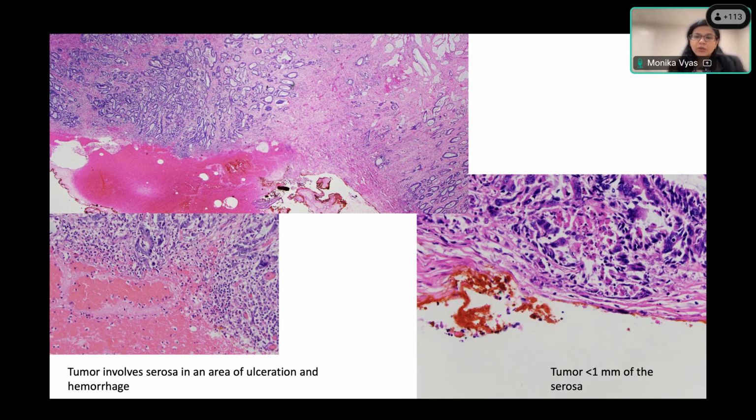So what I do in such situations, but you do see there's like a couple fibroblasts between the serosa. So some people would argue that this is still T3. In these cases, what I do is do multiple levels, and I think in 99% of these cases, I am able to demonstrate tumor on the serosa.